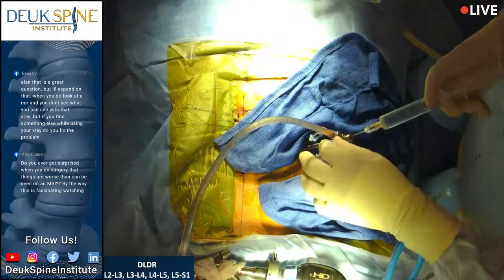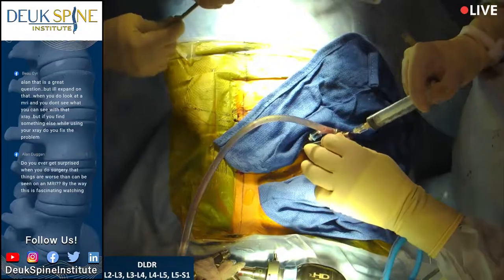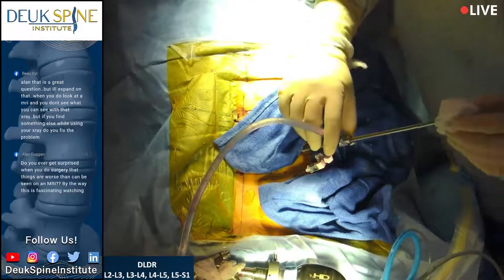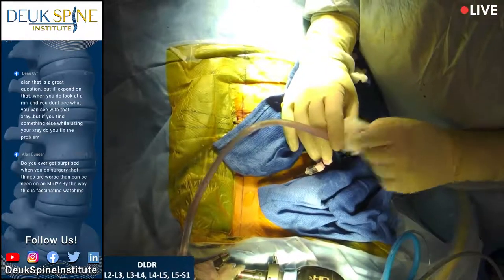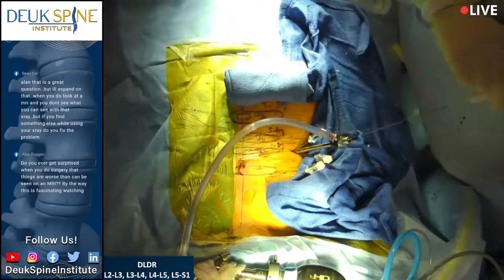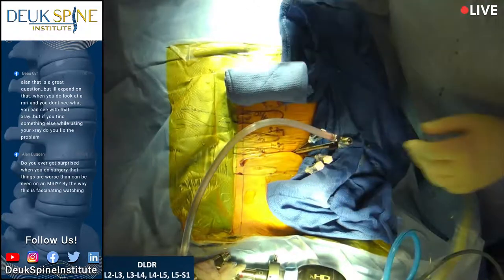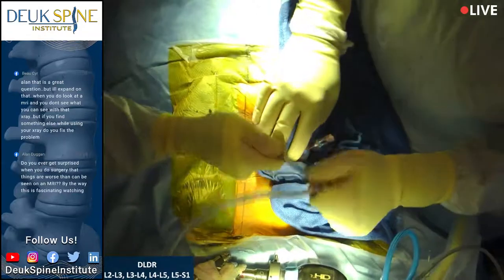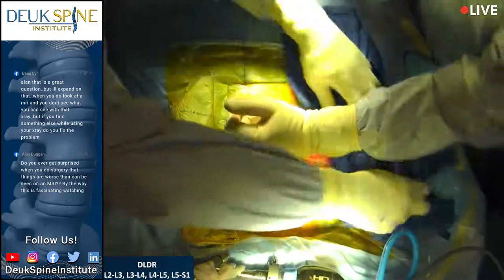Now, if he was having a fusion surgery, maybe we don't want to do a fusion on an 80-year-old. I've done it before. They do fine as long as they're medically fit. I'm sure you'd rather do a fusion because then you can intubate them and just read your books. But the reality is I could fix his back with either fusion or with the laser surgery. And why go through a major fusion surgery if you don't need to? Okay? So he chose the laser surgery, and that's what we're doing.